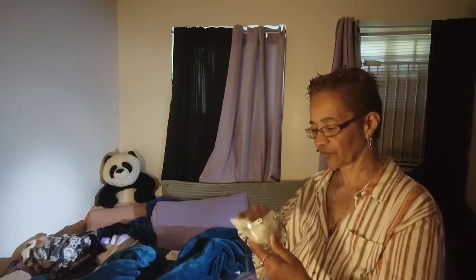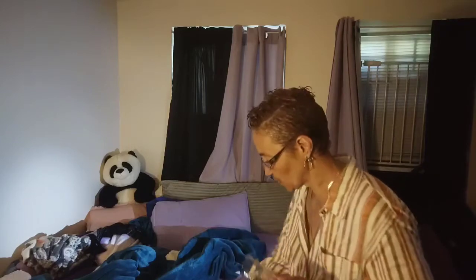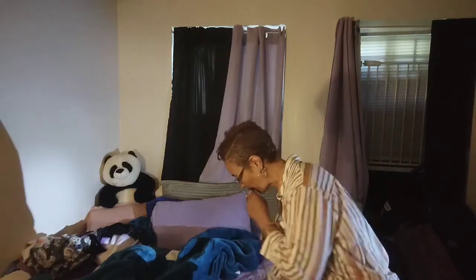And wipe down your stuff with it. Okay, guys, so there we go. Your mask is wiped down. So we're going to put it down and let it air out. Let it air out. So we're going to work on this machine, because I already know how that one works.